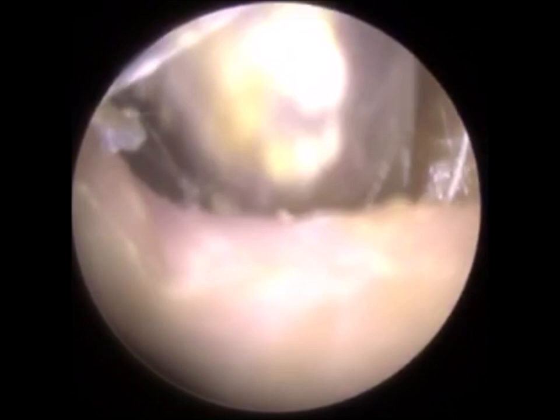It's almost like a magic trick where the magician has a handkerchief underneath their sleeve and they're continuously pulling this handkerchief, handkerchief upon handkerchief. And similarly with this ear, it's a never ending ear. You keep pulling this skin out and out. And just as you think there's no more skin, there's another piece.